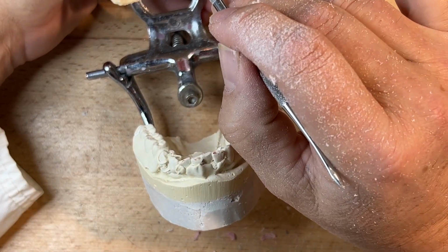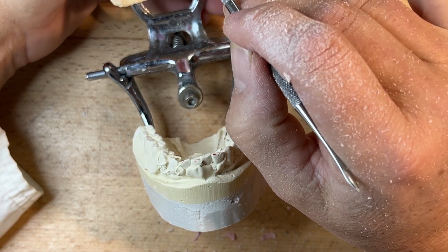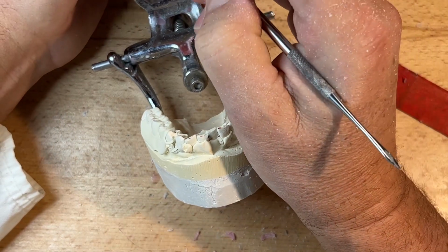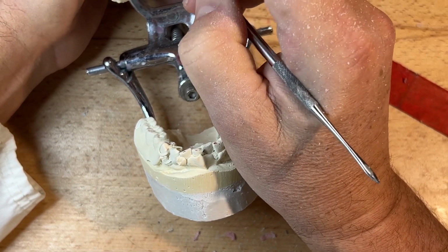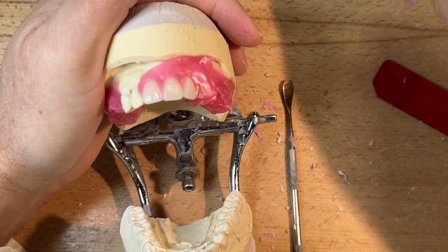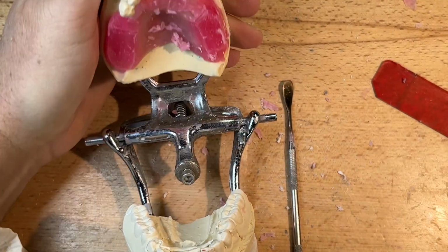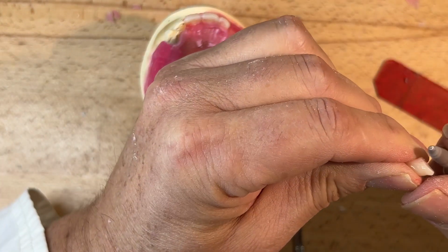After I'm securing now, going backwards a little bit, I got some of the carding wax on the lingual of these teeth. Not a fan of the carding wax, but I've melted it off and blended it in. And during the wax up, I'll be removing any kind of leftover wax. Oof, off the screen again. Apologies. And then maybe we'll fast forward this for viewing simplicity.